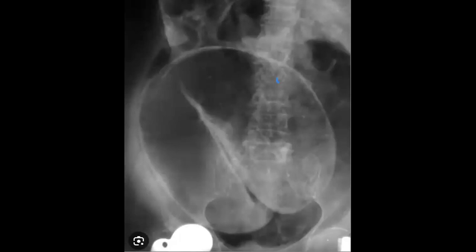They even call it grandma volvulus, as it usually affects old age. Usually pointing in the right upper quadrant, opposite to the cecal volvulus. But anyway, both of them are common to be asked in these points.